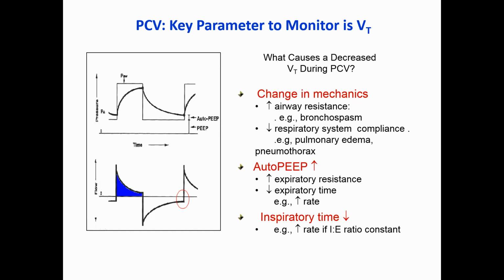For ARDS in particular, there is the newer modality, it's not new anymore, APRV, where you have auto-PEEP trapping there in the lung. And that would be in somebody who's awake, alert, and willing to cooperate with me. This is the first one that I would go to. In ARDS, in asthmatics, the least pressure would be better. I couldn't care less about the rest. I just want to achieve the least pressure possible.